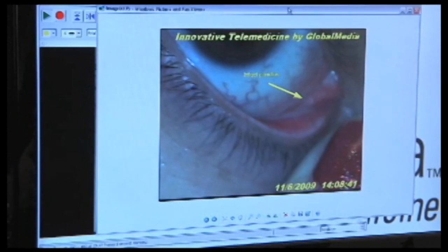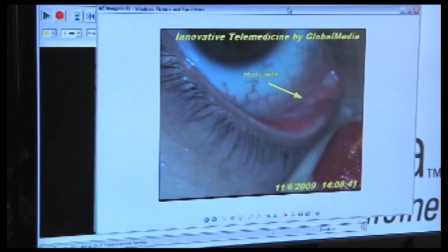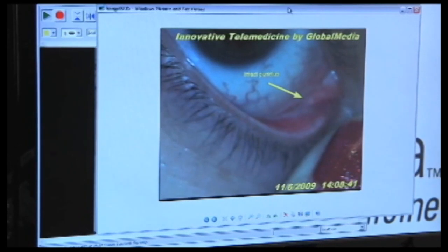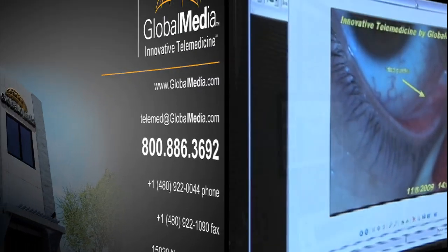So we're doing the visible light imaging from the total exam camera. We're utilizing Capture software from Global Media to grab that image and to store that image and to do it all within a DICOM compliant architecture.